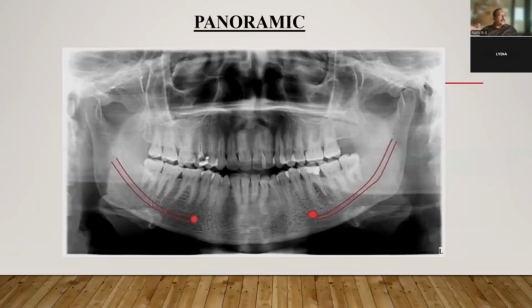Naturally, we don't connect an implant to a natural tooth. The reason is that a natural tooth sinks around 28 microns into the socket, while an implant can sink a maximum of 5 microns alone. So there will be a seesaw action, like a fixed implant region and a movable tooth region connected together, which will naturally help in uprooting the implant area. So that kind of attachment is not done.